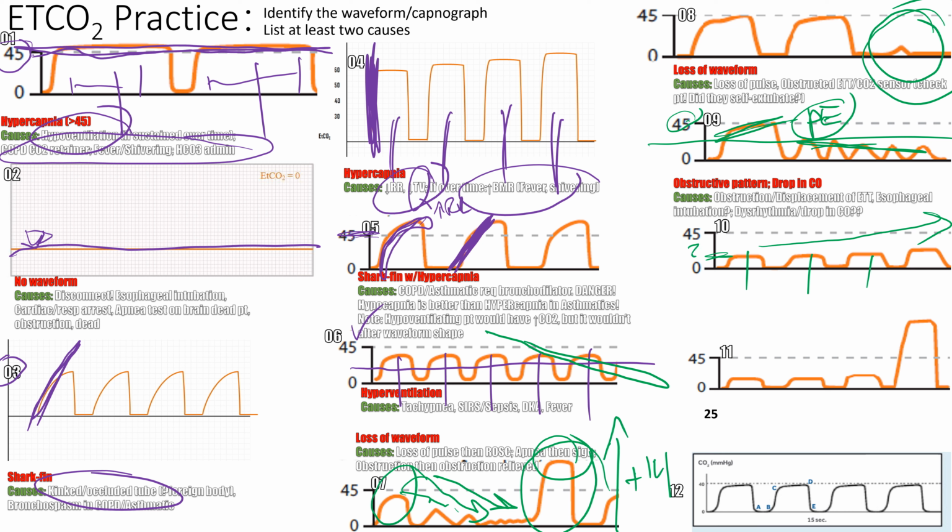If that's like 8 to 10, we're ROSC territory. If we're 25 to 30, then they're breathing slow. That 25 to 30 is going to be 30 to 35, then 40 to 45. It's going to start going up and up and up. It hasn't really hit 45 just yet. All right, and then what else?